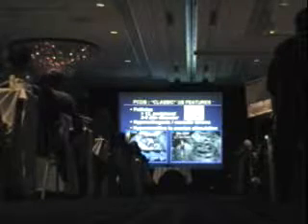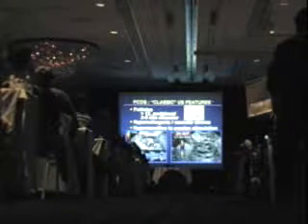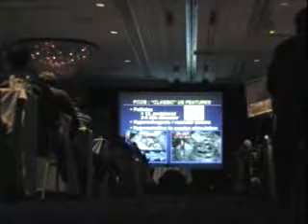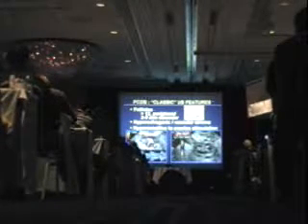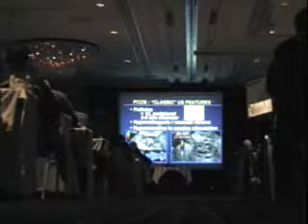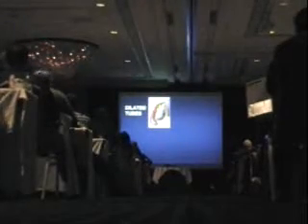Notice that's an avascular ovary. It's a woman on oral contraceptives who is not ovulating, although in most of those women, the ovary is more almond-shaped or elliptical, and here it would be rounder. But, you know, there are exceptions sometimes to those rules.